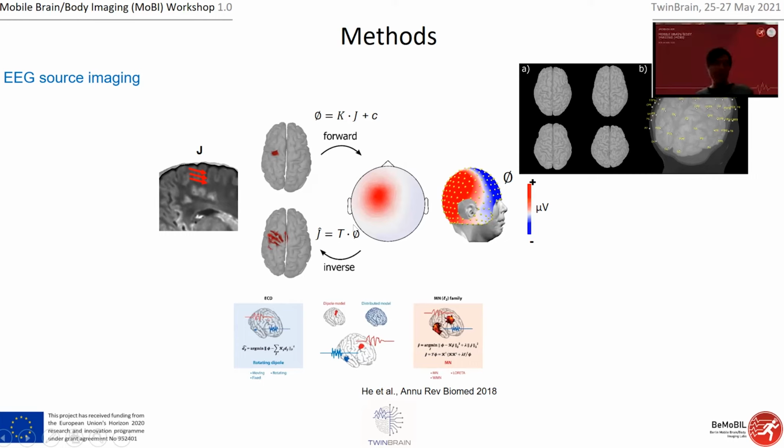And ICs were suggested to be dipolar, and if that is all fulfilled, I think dipole localization is absolutely beautiful, because with 64 channels, the only thing you have to learn is three coordinates and the strength of the dipole. Meaning you don't have to reconstruct a lot of parameters. You can compute the dipole from your topography right away in that case.